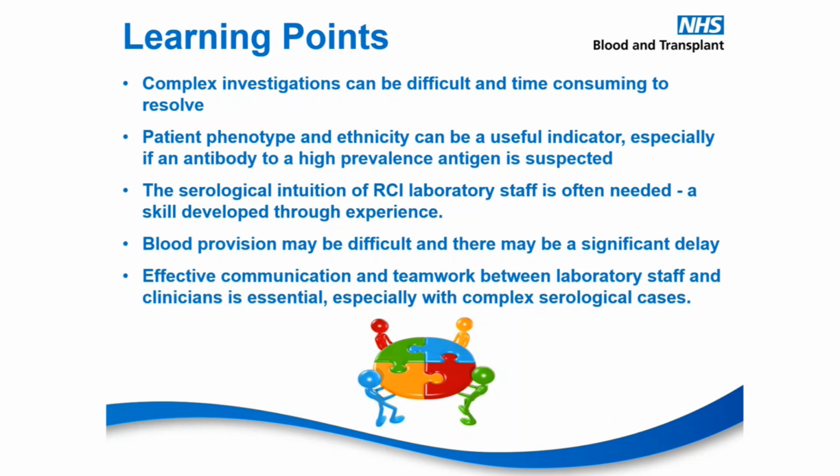And blood provision may be difficult, and there may be significant delays in terms of resourcing from NHSBT in Liverpool, or in terms of instigating that special donor call-up procedure. So be aware of that. And I can't highlight this last point enough: effective communication and teamwork between the laboratory staff at the hospital transfusion laboratory and RCI and the clinicians, both NHSBT and at the referring hospital, is so essential, especially with complex serological cases such as these.